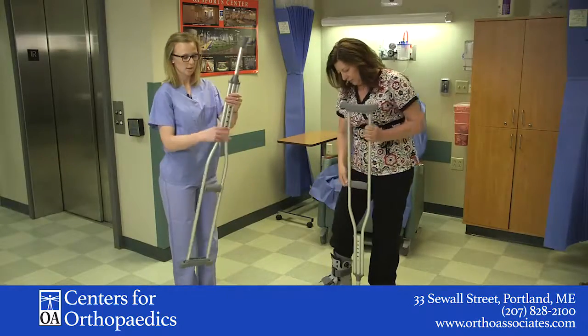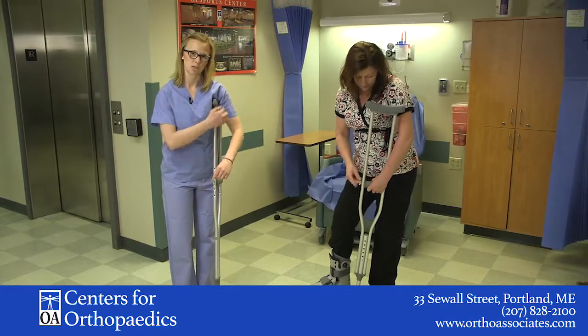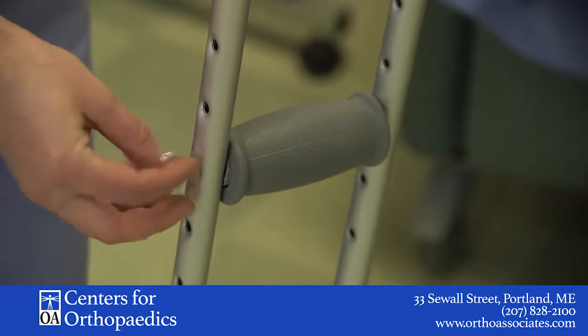You don't want the arms to be straight and putting pressure in the armpits, because you don't want to cause any pressure on the nerve there. So we're going to adjust these.